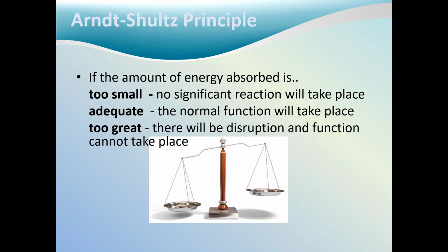The Arndt-Schultz Principle states that in order for energy to affect the body, it must be absorbed by the tissues at a level sufficient to stimulate a physiological response. If the amount of energy absorbed is too small, then no significant reaction will take place. If the amount of energy is too great, then damage results.